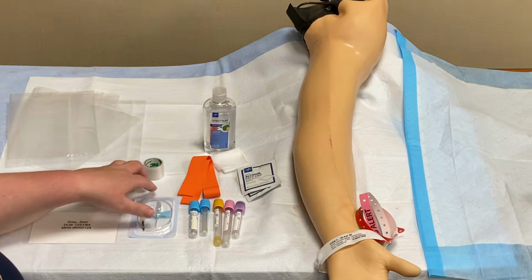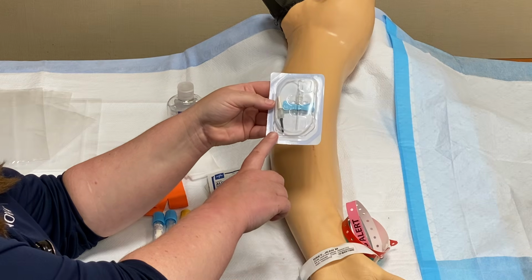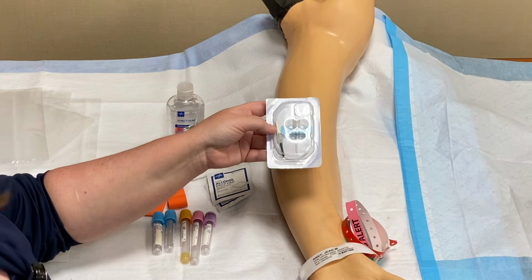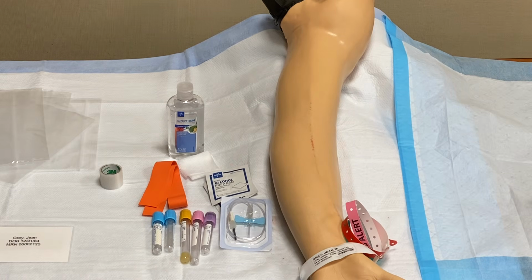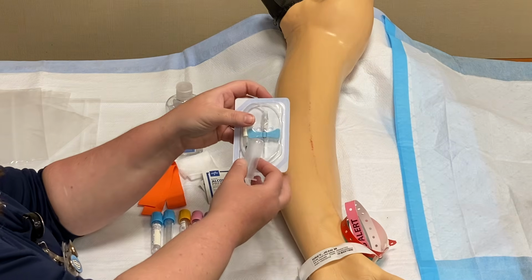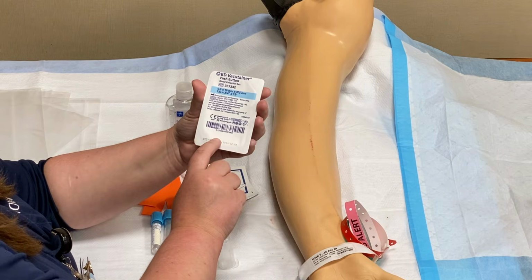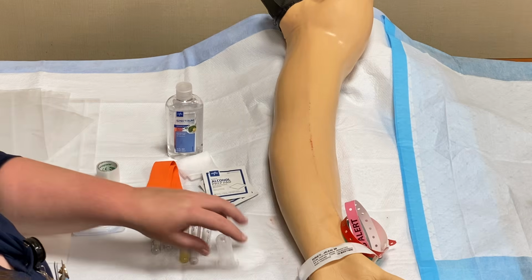So for the butterfly vacutainer method, I want to grab the butterfly needle that has the rubber covered needle on the end of it. This needle can hook up to my transfer device or my vacutainer holder. Let me grab that real quick from the other shelf in the supply room. Here we go. It hooks up to the vacutainer holder, so that'll screw right on there to hold the tubes in place. I want to make sure that I check the expiration date on all of my supplies as I grab them from the supply room.